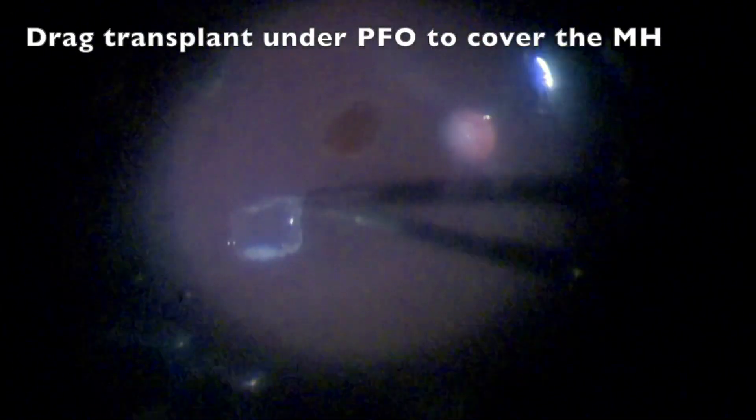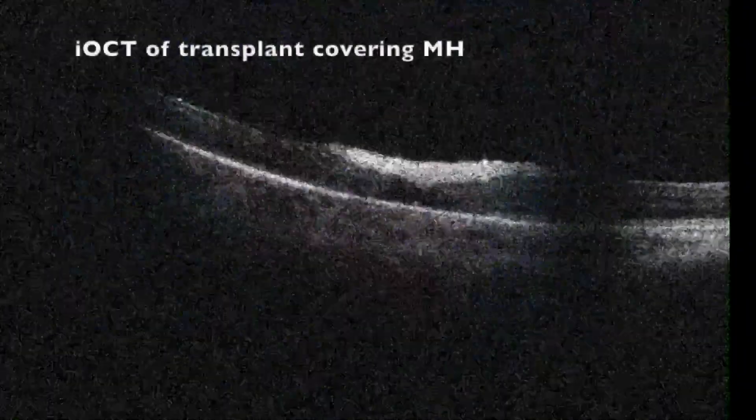PFO was instilled covering the harvest site, and the surgeon used vertical pneumatic scissors to excise the graft. The transplant is then dragged under the PFO to cover the macular hole.